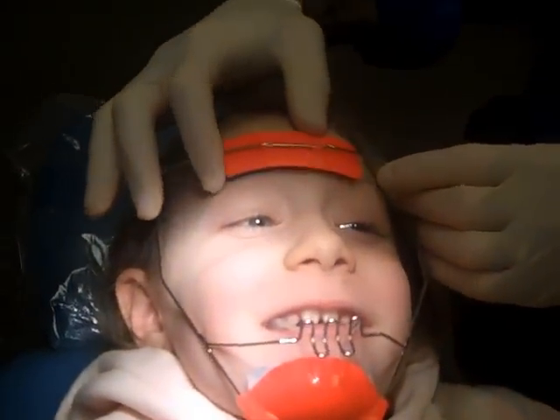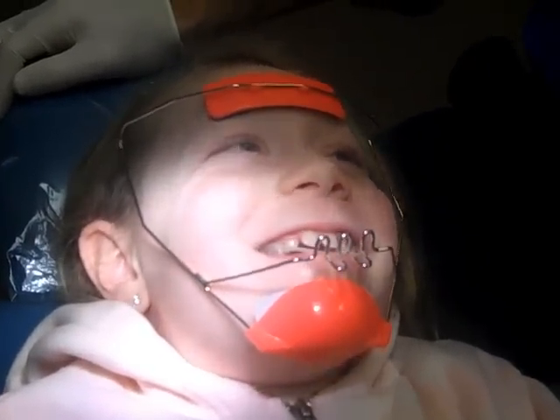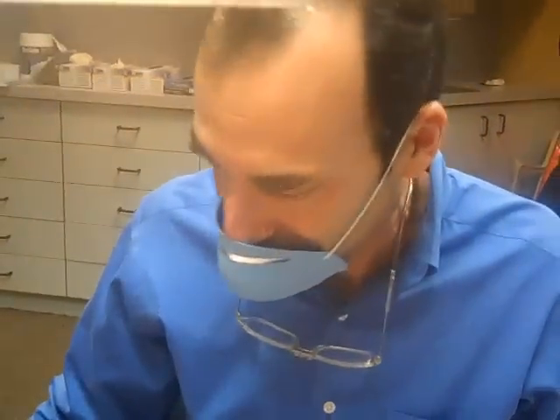Logan, what do you have to say now with this mask on your head? Anything? Speechless? We want to thank you for your cooperation today so all the other children can see how easy this procedure is. Good luck in the contest.